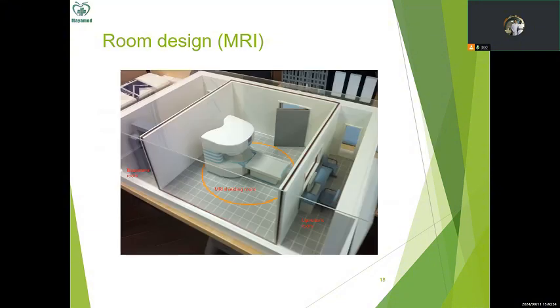In the equipment room, we place the cabinet. In the shielding room, we place the main system. The operator's room is actually for the doctor, the operator and the radiologist. So they line up like this.